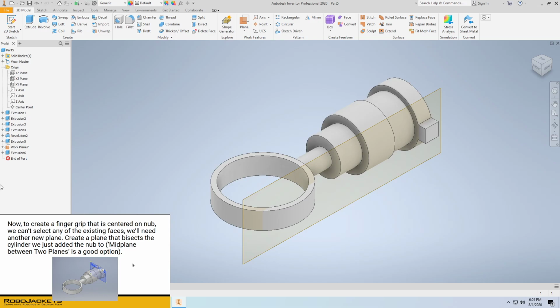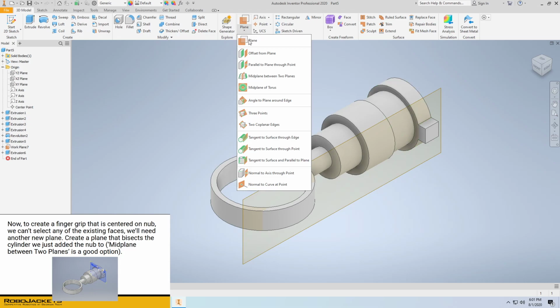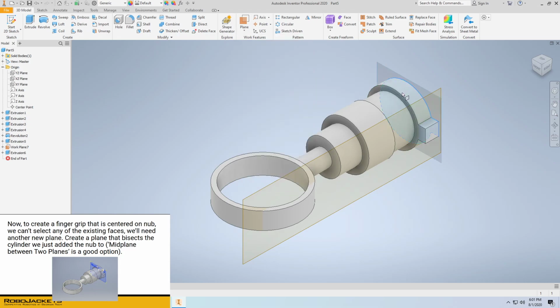Now we're going to create the actual finger holds. To do that, we'll need a work plane that goes directly in between the two surfaces of our last cylinder. We'll create that by using the mid-plane between two planes tool, selecting the bottom and top planes, get a bisecting plane. Now we'll go ahead and create a sketch on that plane. Here we go.